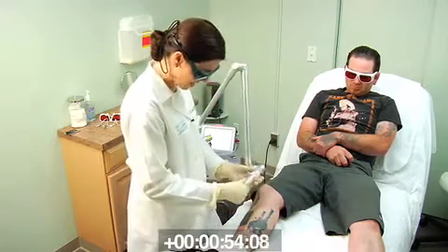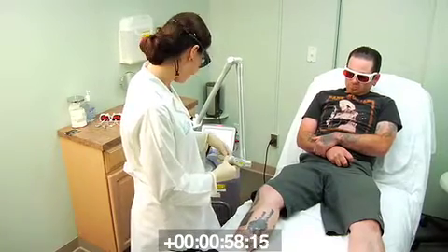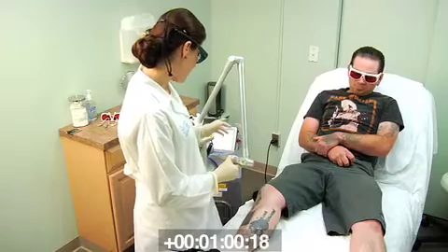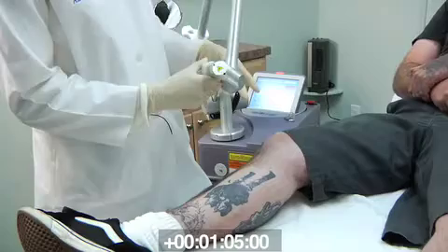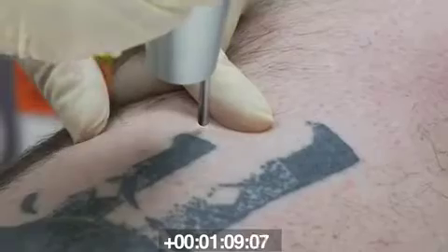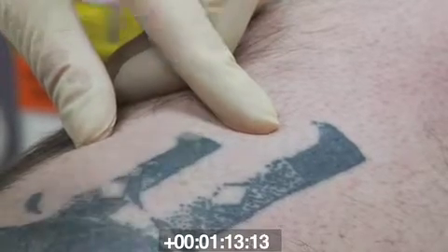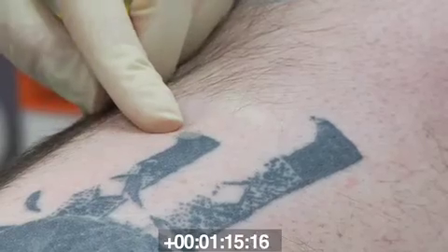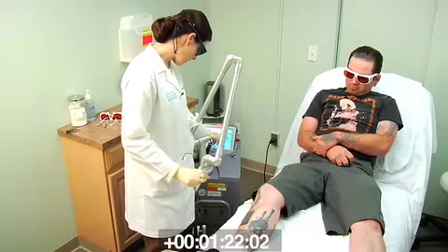So I'm going to confirm my handpiece is 1064 nanometers, 6 millimeter spot, 1064 nanometers on my faceplate, 6 millimeter spot, 0.9 joules, and 10 hertz. I'm going to do a test spot right here. 3, 2, 1. And this spot here is not quite white enough or crisp enough for me, so I'm going to go up in my fluence. But it was a very nice, safe starting point.